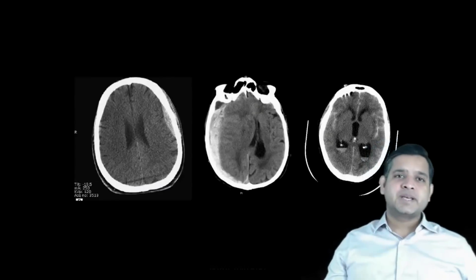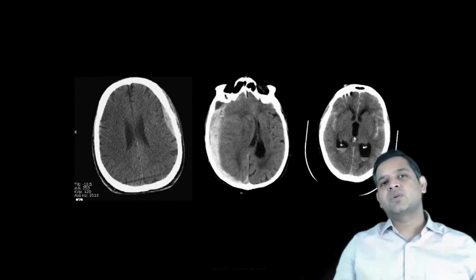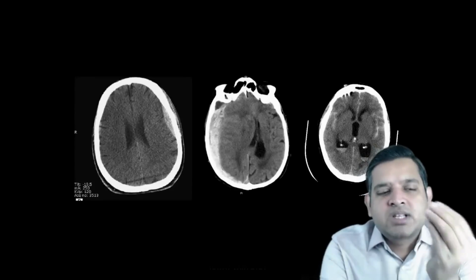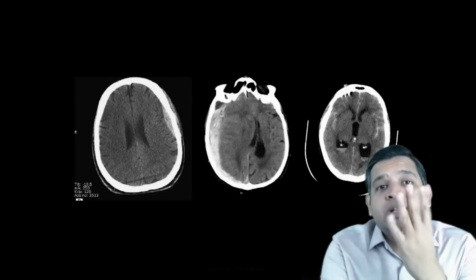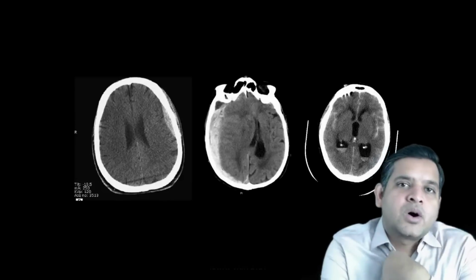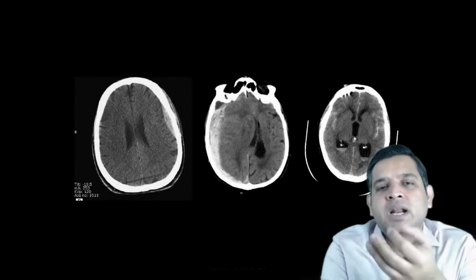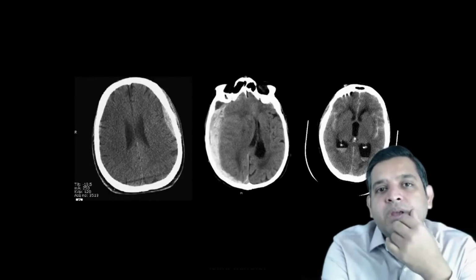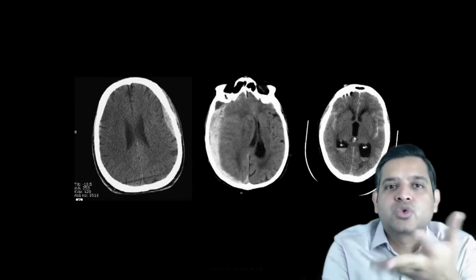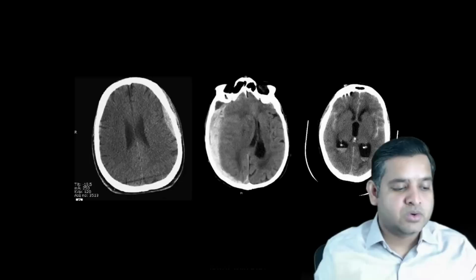So that was the basic anatomy on a radiological section that I want all of you to be aware of. Sometimes the examiners are also very fond of asking some of this anatomy, like they will give you the chest x-ray, and on a chest x-ray they will mark a bone and ask you what that bone is, like they will mark a coracoid process. I think you will be able to pick up the coracoid process of the scapula, or the acromion process of the scapula. They might give you the X-ray of the elbow joint and mark a medial epicondyle or a lateral epicondyle or a trochlea. Or they can give you the X-ray of the hand and ask you about a carpal bone. So please make sure that you are able to do that.